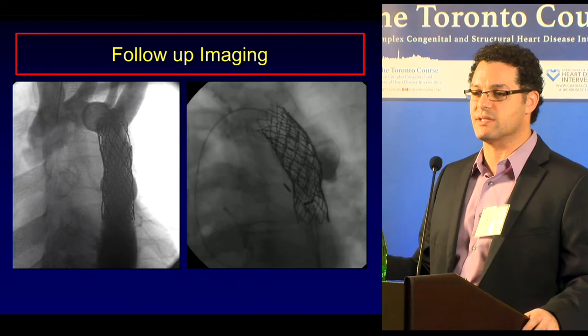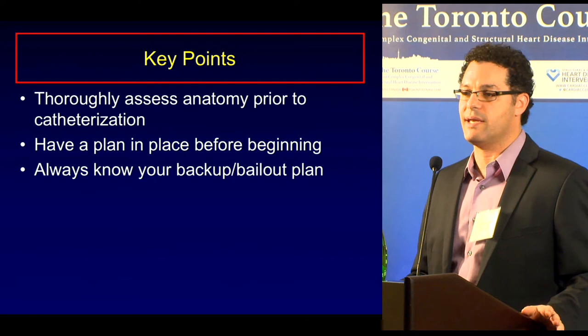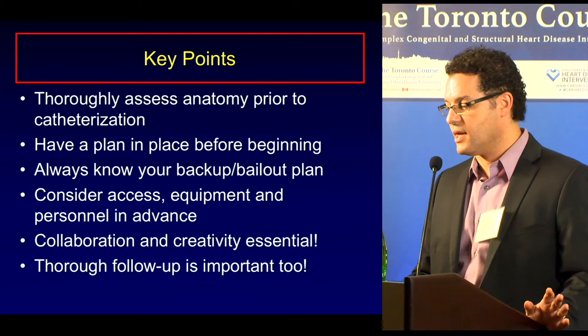All right, so key points. Thoroughly assess the anatomy prior to the catheterization. Have a plan in place before beginning. Always know what your backup and your bailout plan is, because you're not sure how everything's going to respond. Consider access, equipment, and all personnel in advance. Collaboration and creativity are both essential for these cases, and thorough follow-up is important too. So thank you. I have one other key point.